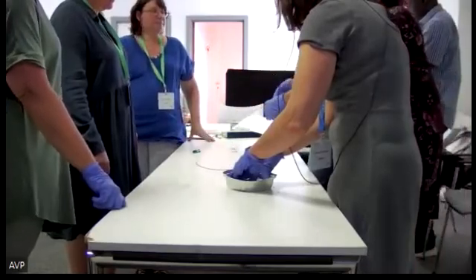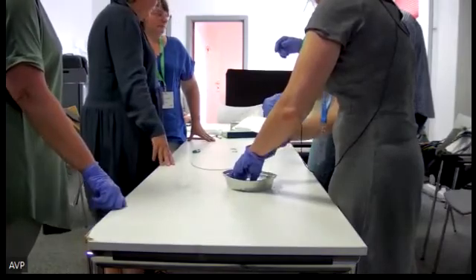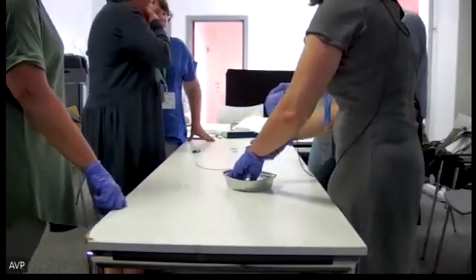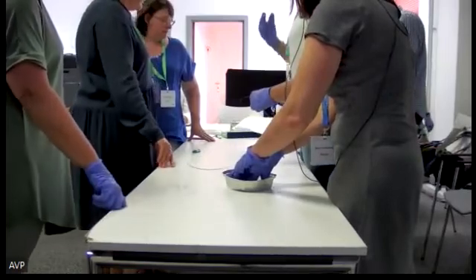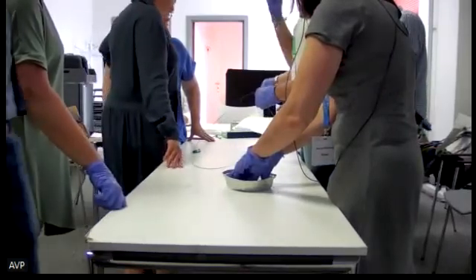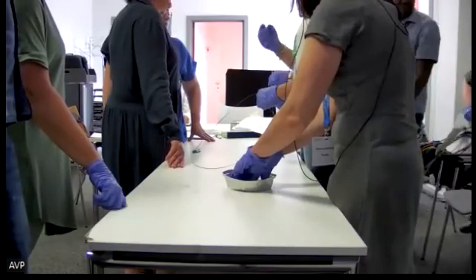Okay. And usually they're all mounted already. When we work on one wire, they're already preparing the second wire. Alors, the question is, why not put only one guide wire and use the fusion system to put two stents?